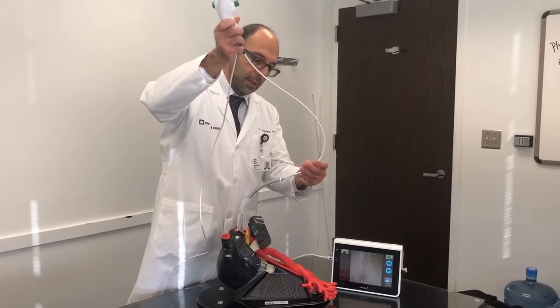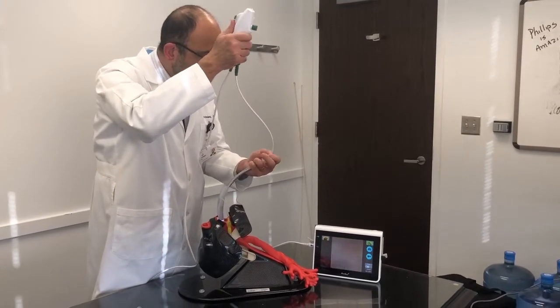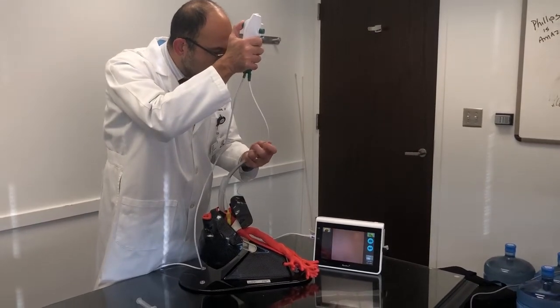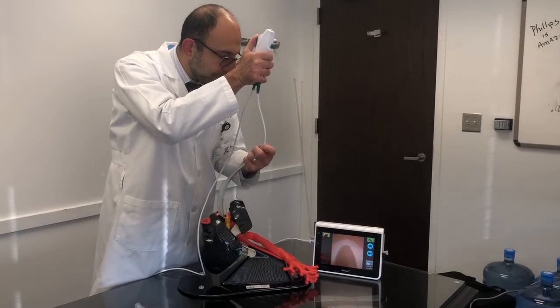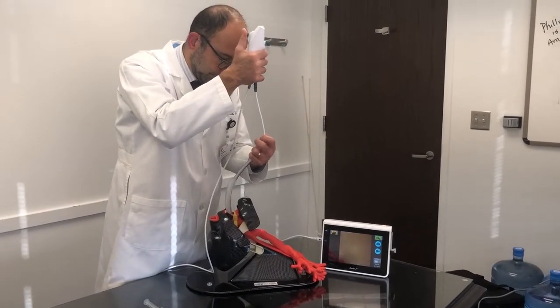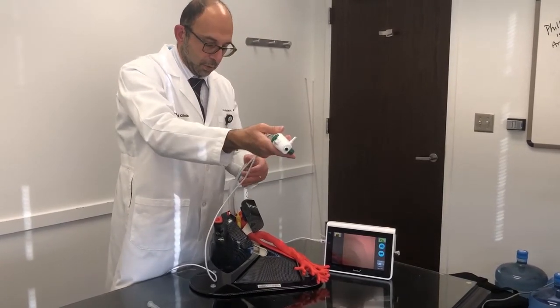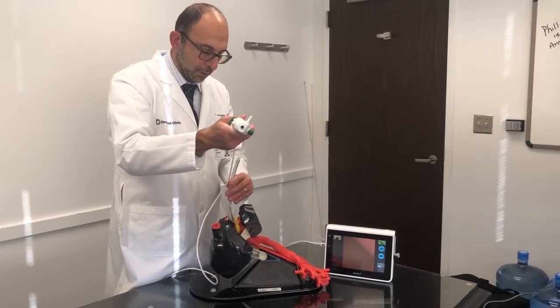With the fiber optic assistance, we can visualize the vocal cords and introduce the endotracheal tube inside the trachea.